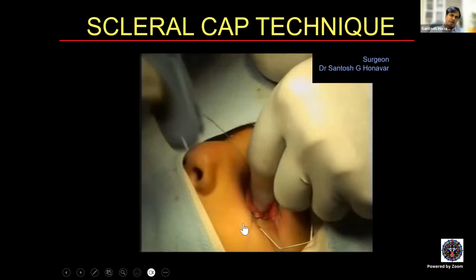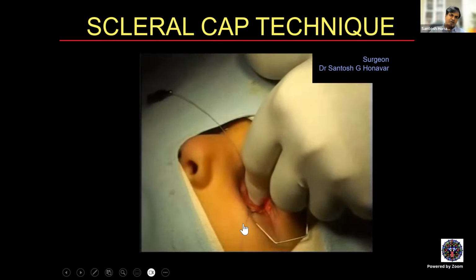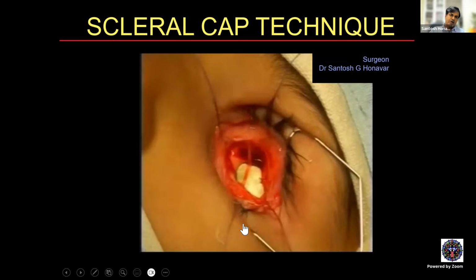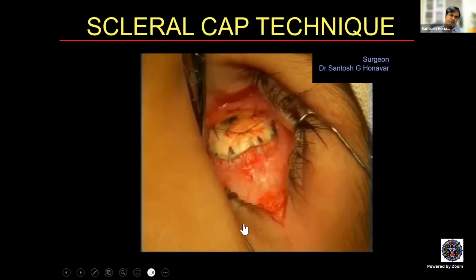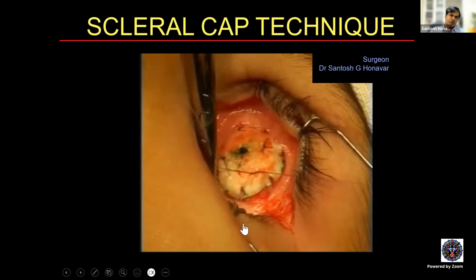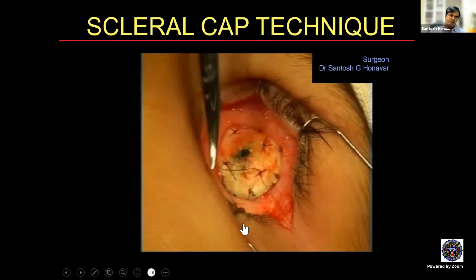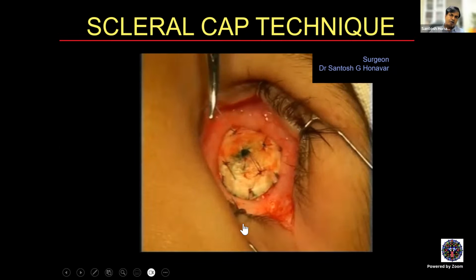It has a split, so it comes out through the fingers. And you know the center of the implant. So each of the extraocular muscles is sutured to the sclera. The center is the center of the implant, that violet dot.